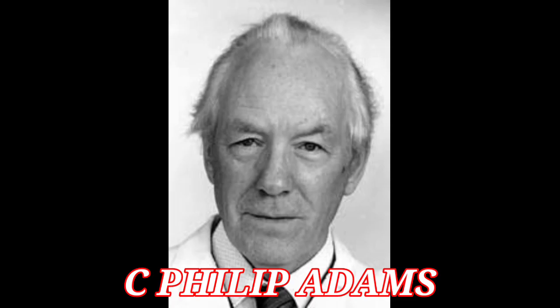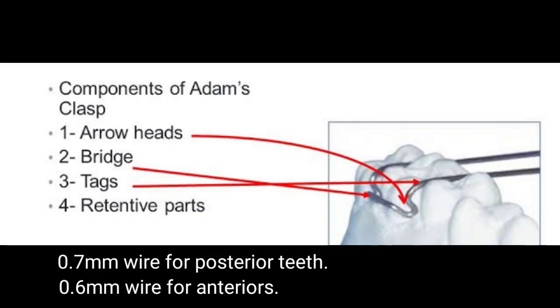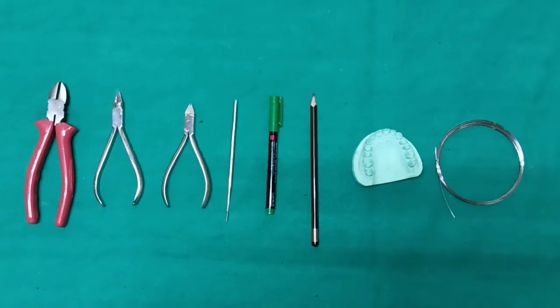Adams clasp was introduced by Philip Adams in the year 1949. Two arrowheads, bridge, and two retentive arms are the parts of Adams clasp. The other synonyms of this clasp are modified arrowhead clasp, universal clasp, and Liverpool clasp.